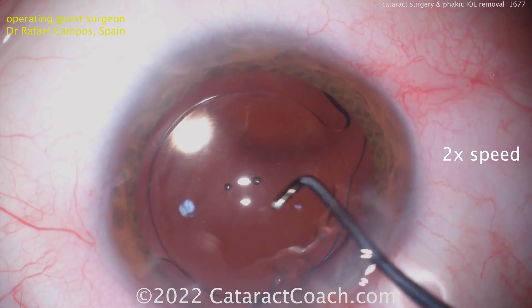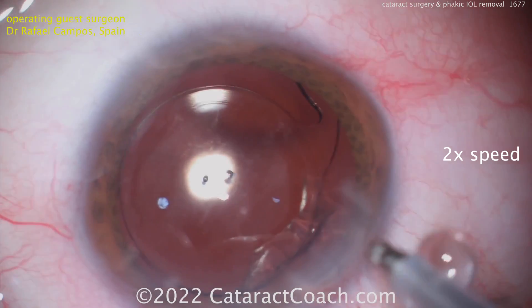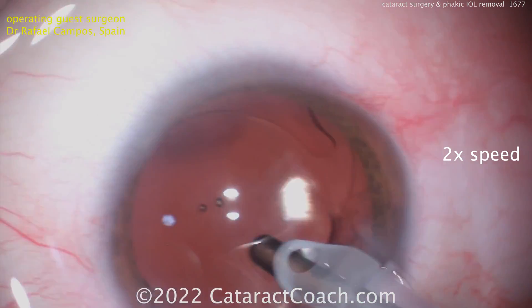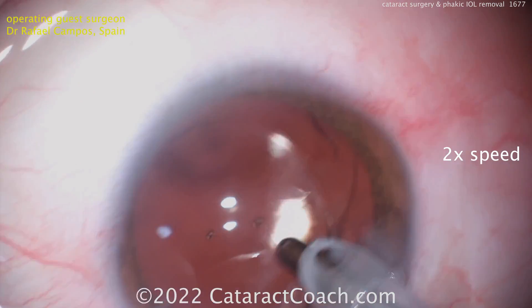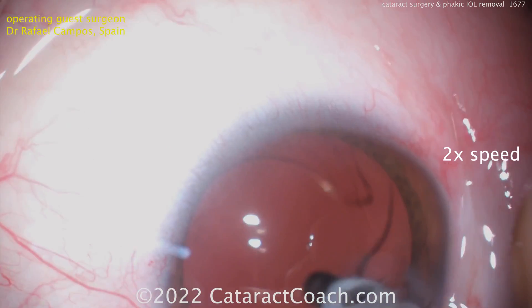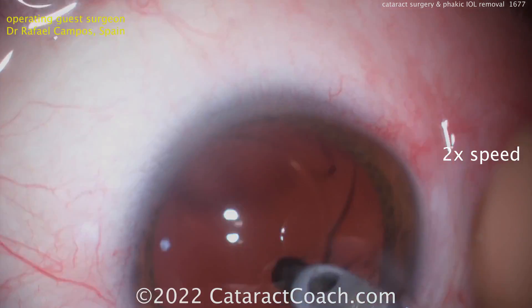Get that lens centered — nice-looking rhexis too. Look at the overlap. Beautiful. Let's take out the cortex from the sub-incisional area and finish this case up.